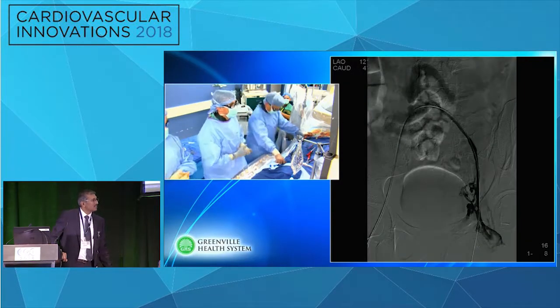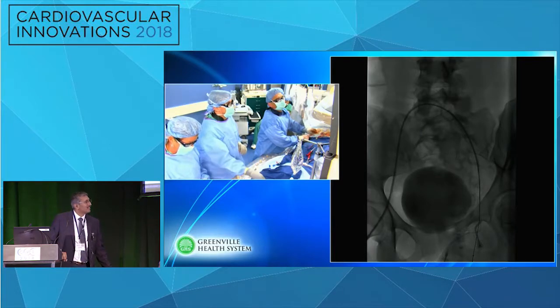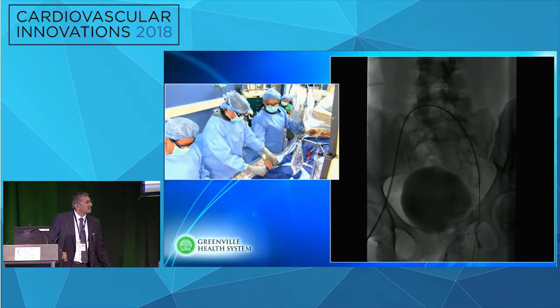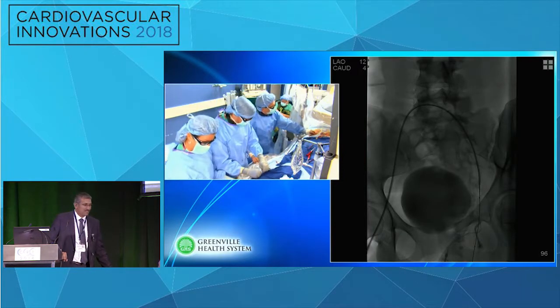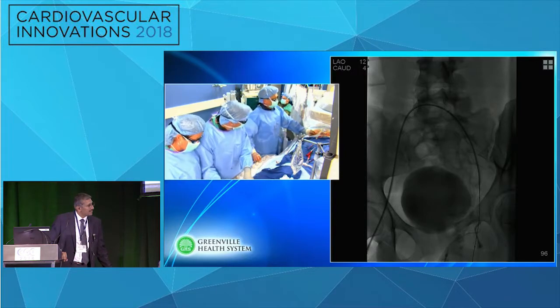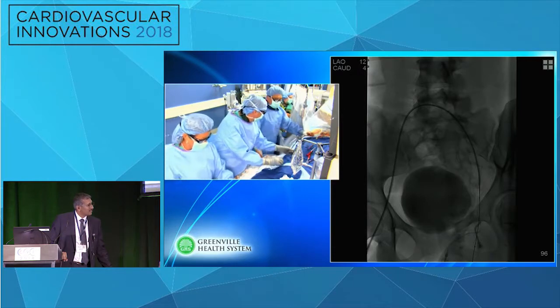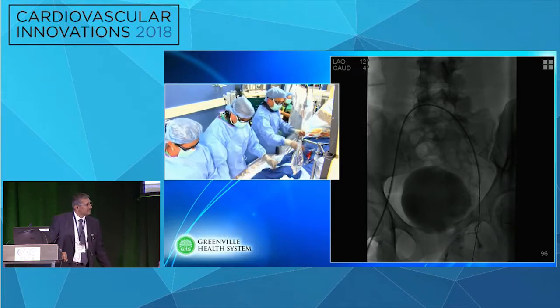You don't agree, Munir, yet? No, I really think it's not a common femoral vein. It is either organized or the wall is scarred or something, so it's not a normal vein. A normal common femoral vein is huge. And the other thing, I usually use a very long balloon, 8 to start with, even 200, so I don't have to keep dilating. And then we put the stent the way it's needed.